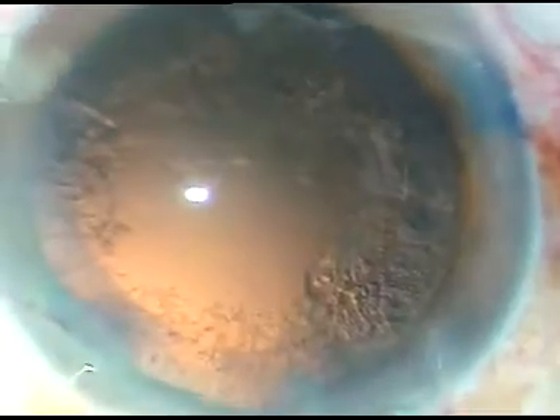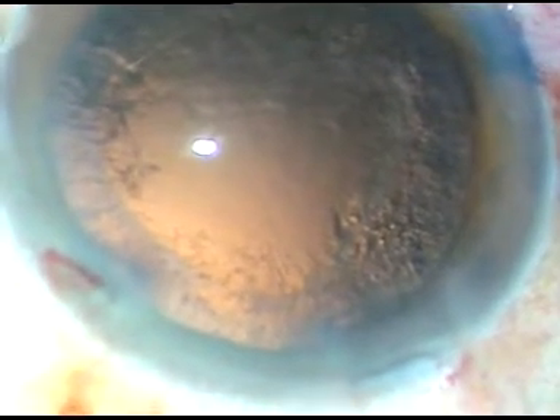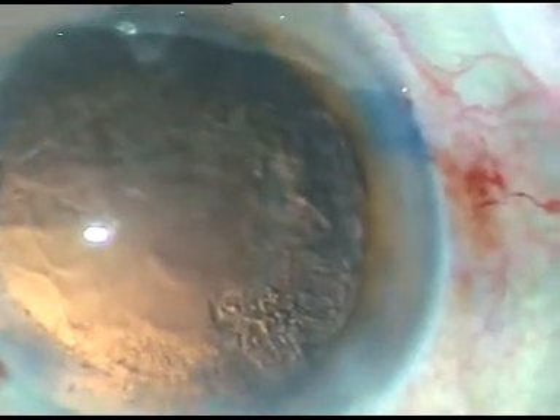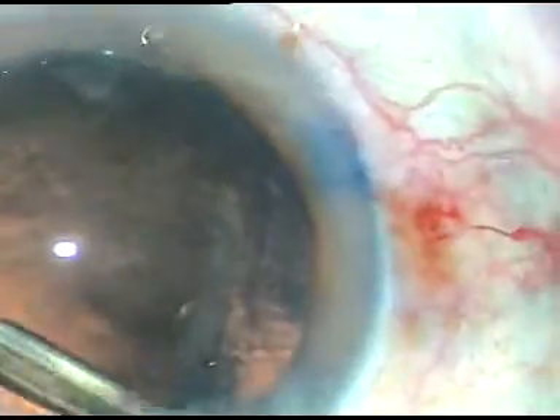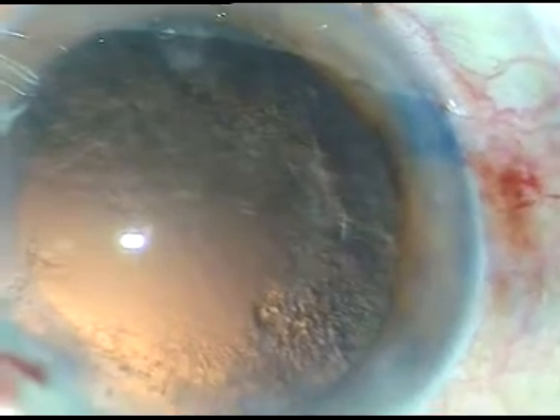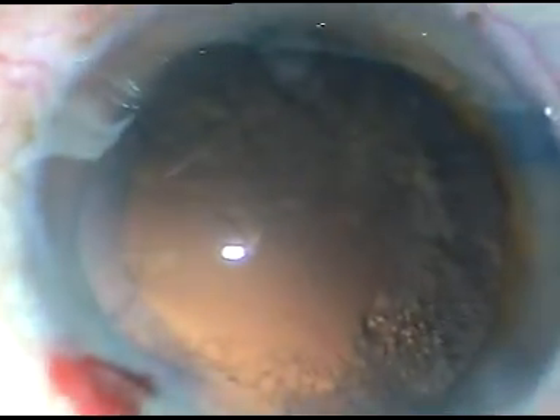This is the last beat of nuclear fragment. Now in such cataracts, a lot of cells stick to the posterior capsule like this. Nowadays, I just dislodge these cells with irrigation — with the irrigating probe of bimanual IA. If I try to do polishing with a Simcoe cannula, I can cause a small PC rent which is not desirable.